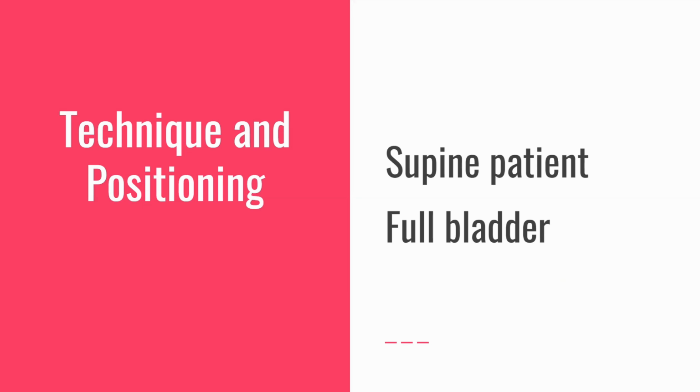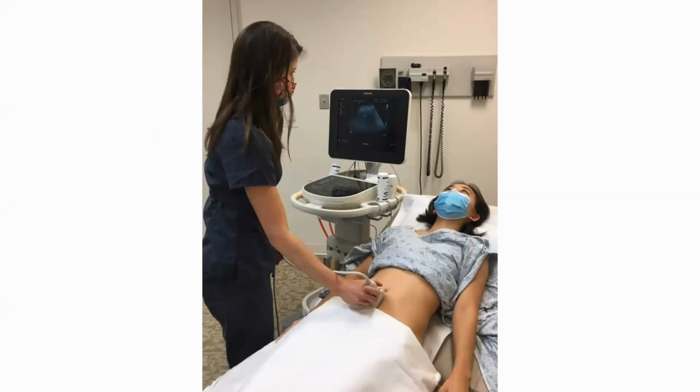Alternatively, if your patient needs an IV or blood draw regardless, and is stable, you can infuse IV fluids rapidly and then take a look. It should fill up the bladder much more rapidly than PO fluids would. And this is important because, of course, transabdominally, you're going to be using the bladder as your acoustic window to get much better resolution of what's behind it.